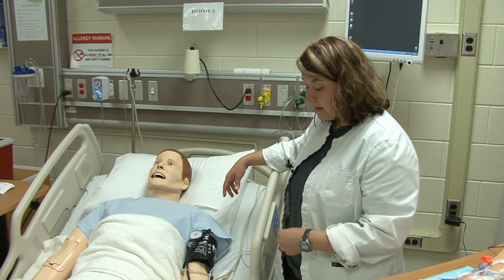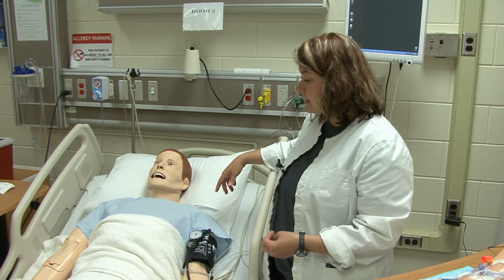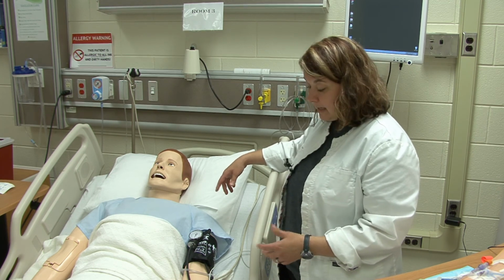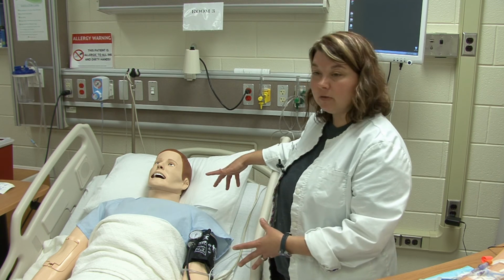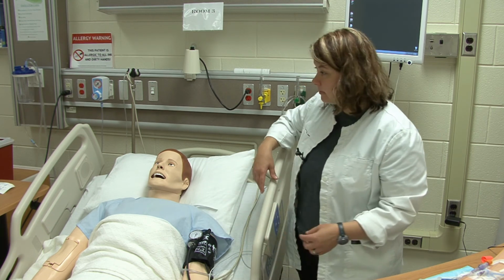Also, for patency, you need to flush the IV at least once a shift or whatever your hospital policy says to make sure that it is patent. But again, if I came back in and I needed to start IV fluids on him, I would need to make sure to flush it and make sure that everything is what it needs to be and that it is patent.